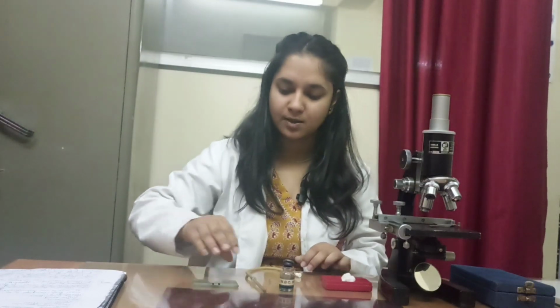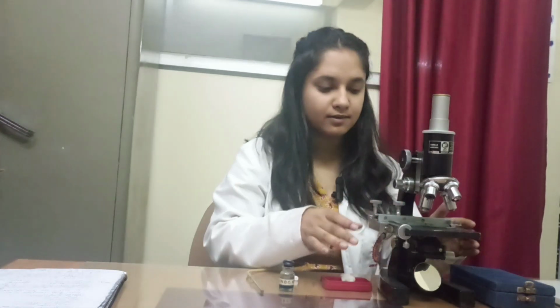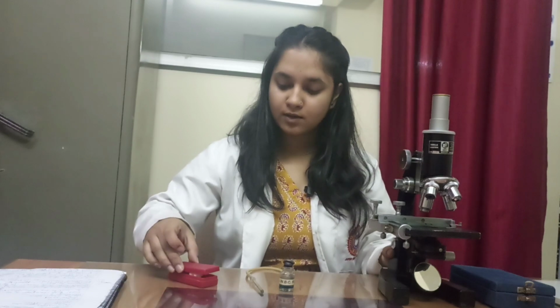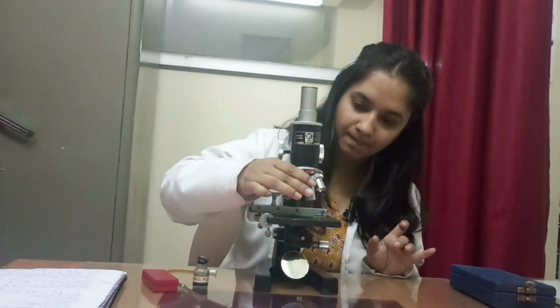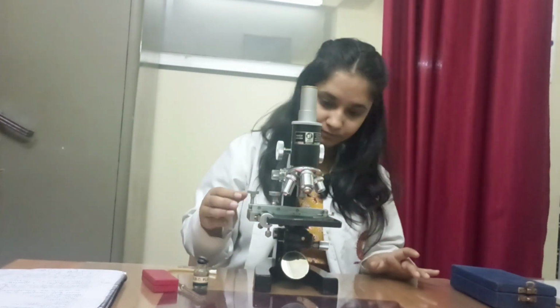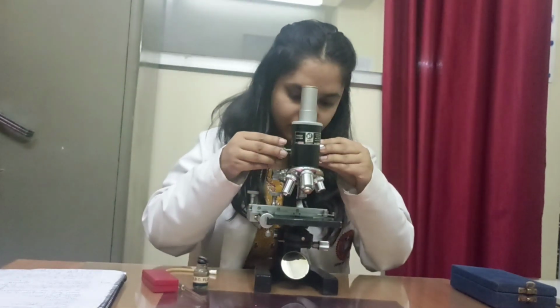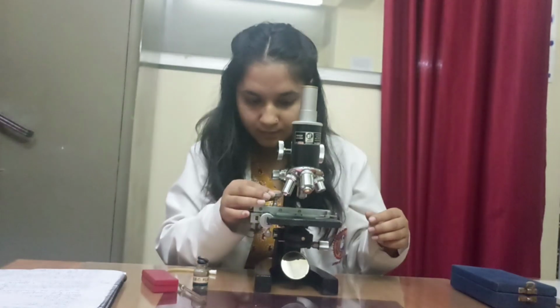After charging this Neubauer chamber, we put it under the microscope and we focus the Neubauer chamber on 10x, the low power magnification.